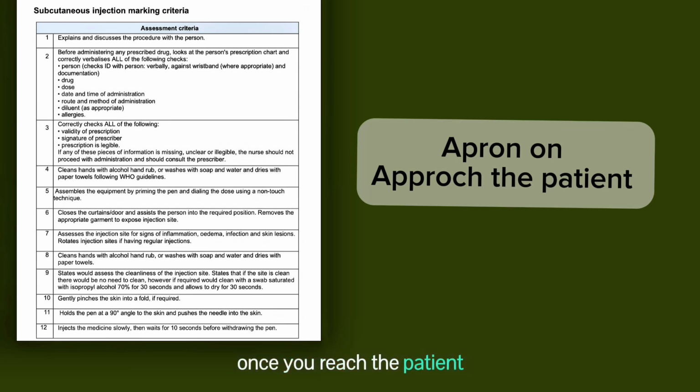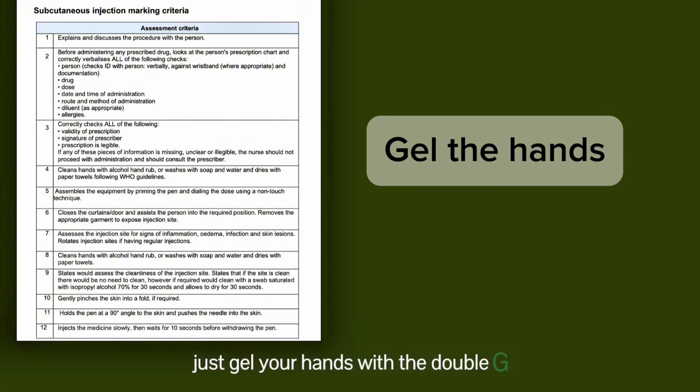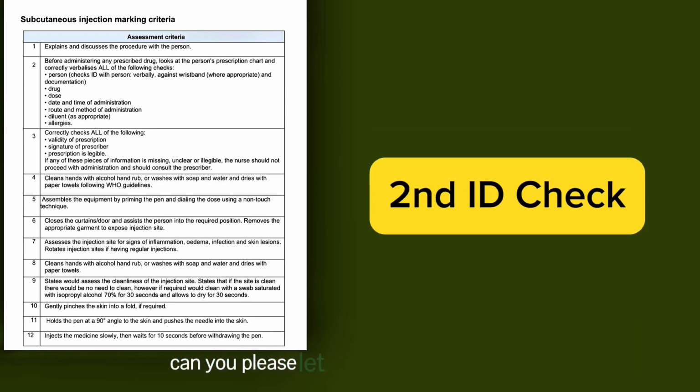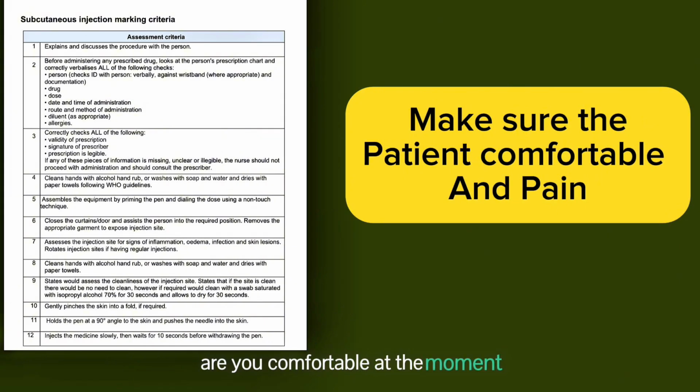Once you reach the patient, just gel your hands with the WHO guidelines and verbalize, let it dry for 30 seconds. Hi Patricia, I am back. Let me just wear my gloves. Before I prepare the medication, can you please let me know your full name, your date of birth and your address? You don't have any allergies, right? So I can confirm that I am with the right patient. Are you comfortable at the moment? Are you in any pain at all?